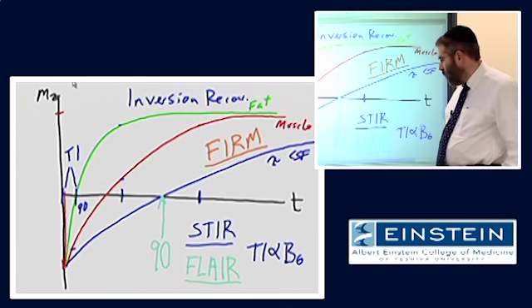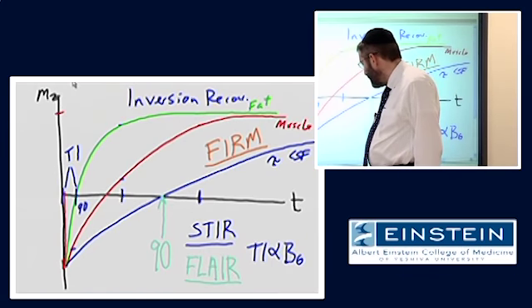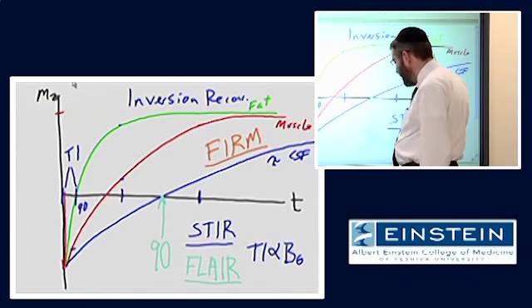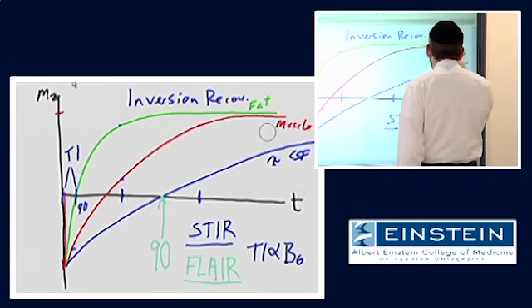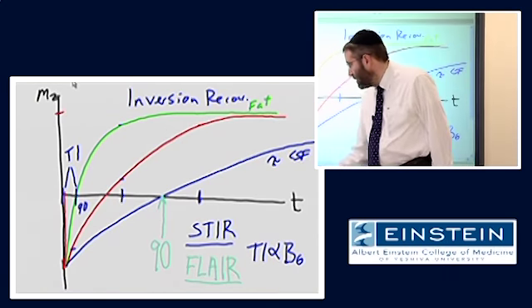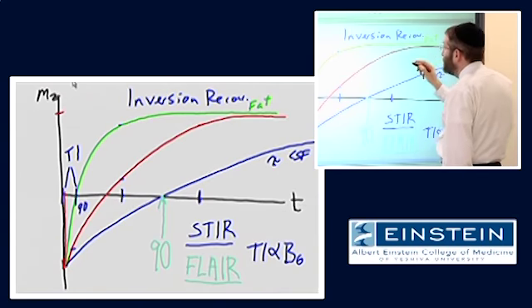Okay. Now, one other feature of inversion recovery that we need to be cognizant of is, let's say that instead of muscle, well, this could still be muscle.